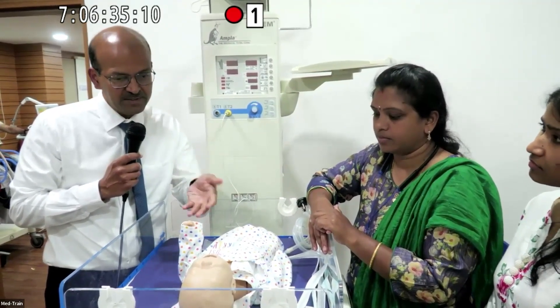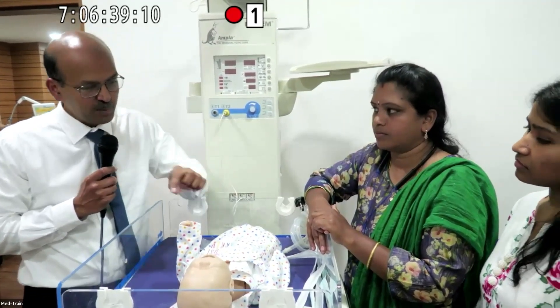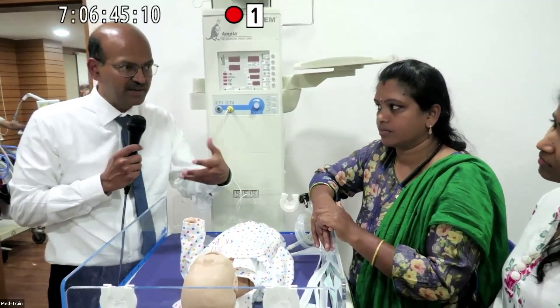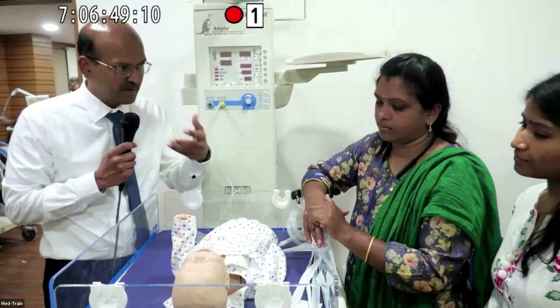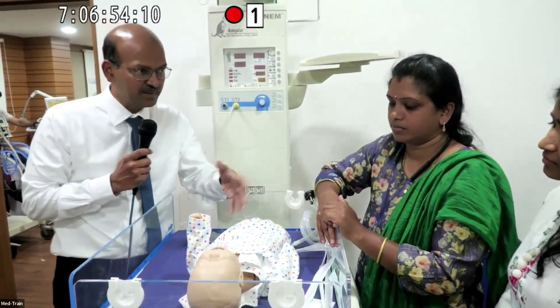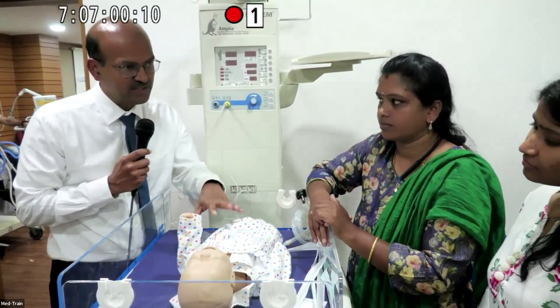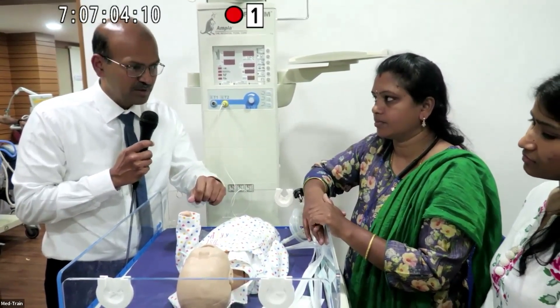In non-invasive ventilation, maintain appropriate humidity and appropriate-sized fixing devices. Ensure fixing is without pain or discomfort, as a distressed baby will cry more. Use kangaroo mother care to help settle the baby. Use saline drops but don't suction unnecessarily, and avoid deep suction unless the airway is not patent.